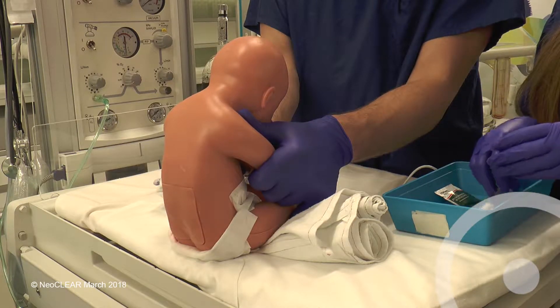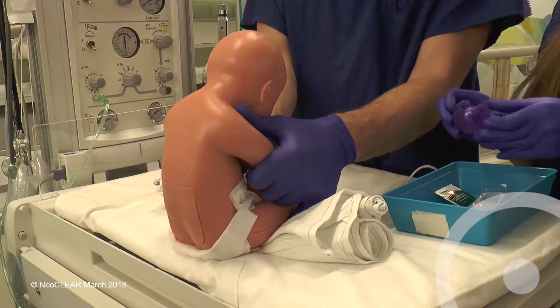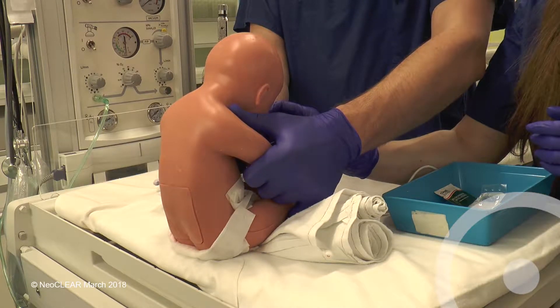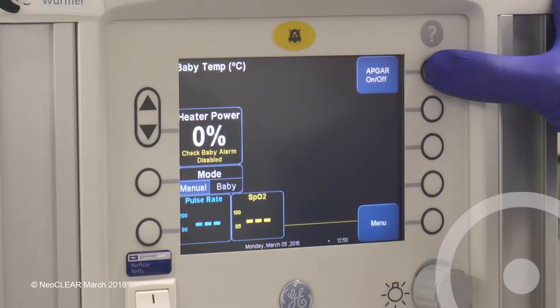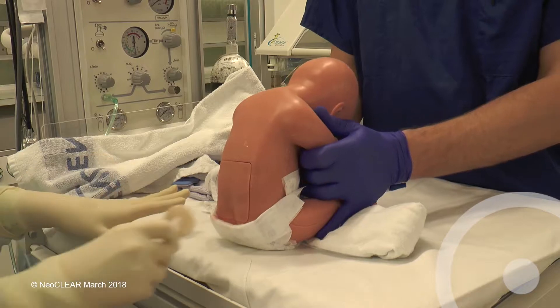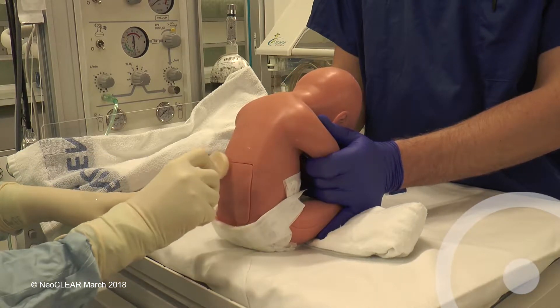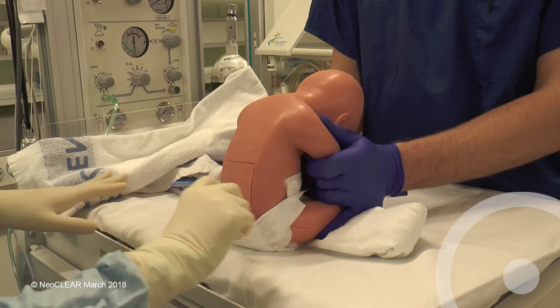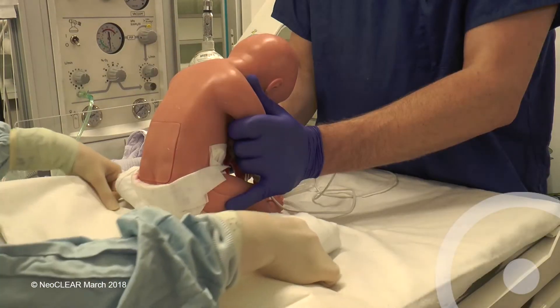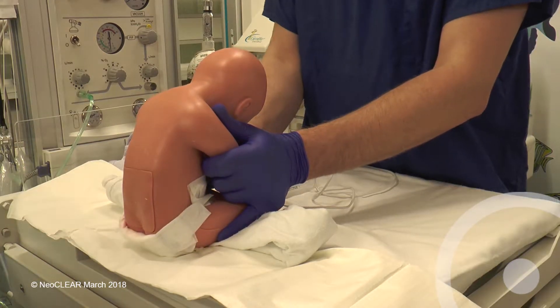The infant may be given a few drops of milk or sucrose solution before the procedure and again during the LP if needed. The second assistant should begin timing at the start of cleaning the skin. Clean in a spiral from the lumbar region out to the iliac crests. This should be done three times and allow to dry for 30 seconds. Place the baby on a sterile drape and remove the outer gloves.